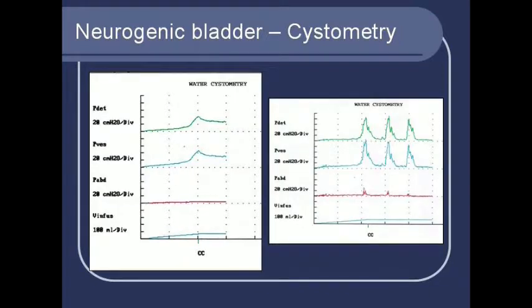In this particular child, the pressure is not rising that much, but there is again detrusor overactivity. And now I'm getting confused with the terminology myself. Detrusor overactivity, which causes intermittent contractions and leakage. Now this particular child, again a meningomyelocele patient, the pressure seems to be okay for a little while, and at a very low volume it rapidly rises, and then she starts leaking and the pressure falls a bit. Now here there is not much muscular action at all.